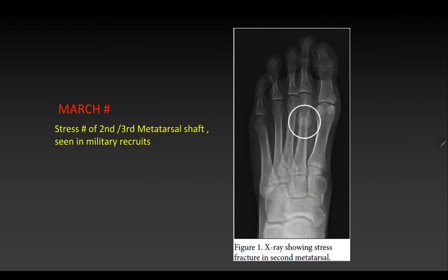Another named fracture is the March fracture, which is a stress fracture of the second or third metatarsal shaft seen in military recruits. When they go marching, too much pressure is applied for long periods of time, leading to stress fractures. You can see a fracture line with a lot of soft tissue edema.